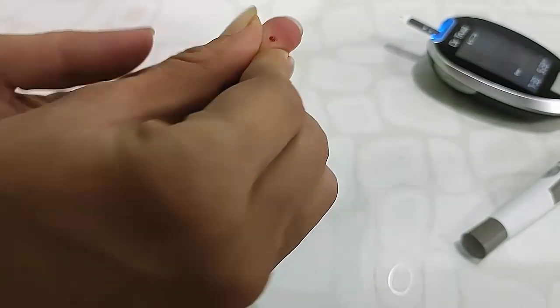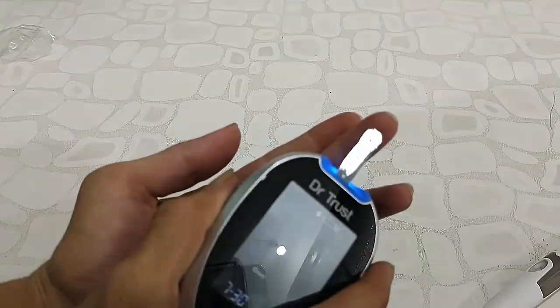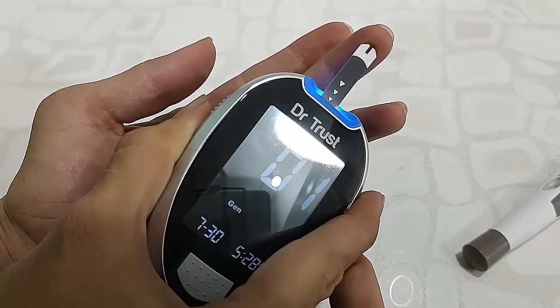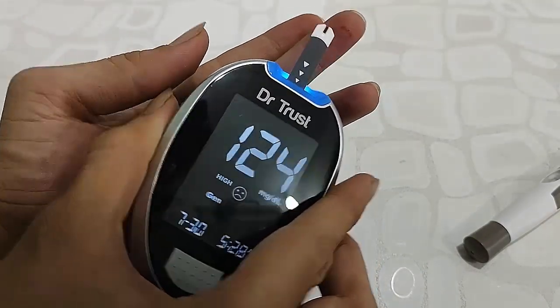Take the machine and hold it to the blood sample on your finger. You will get a result within four seconds. We got the result, as you can see here.